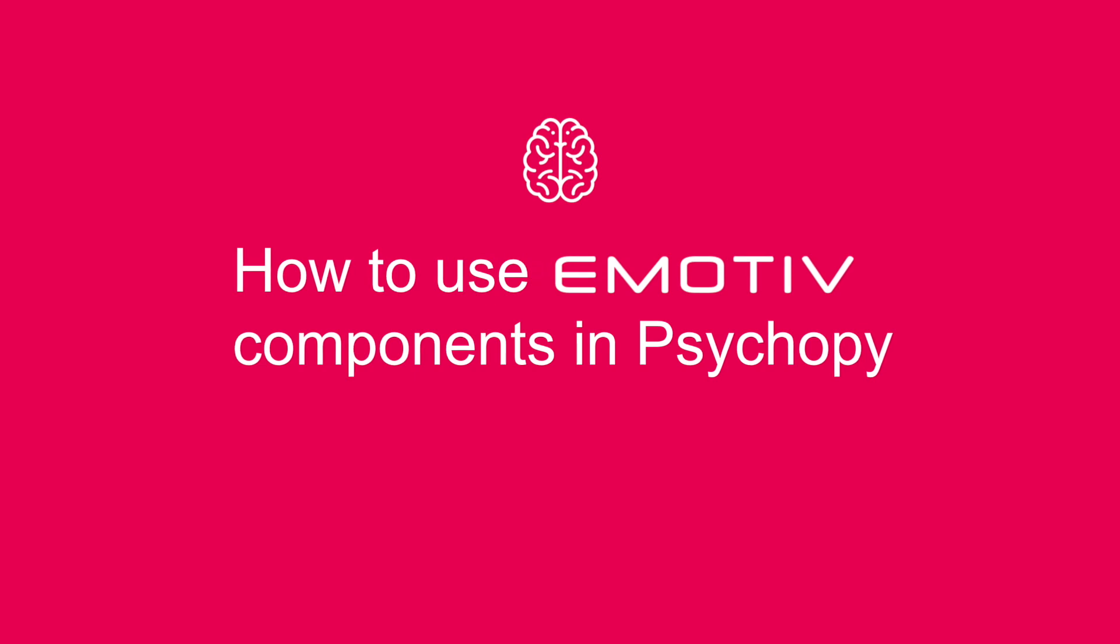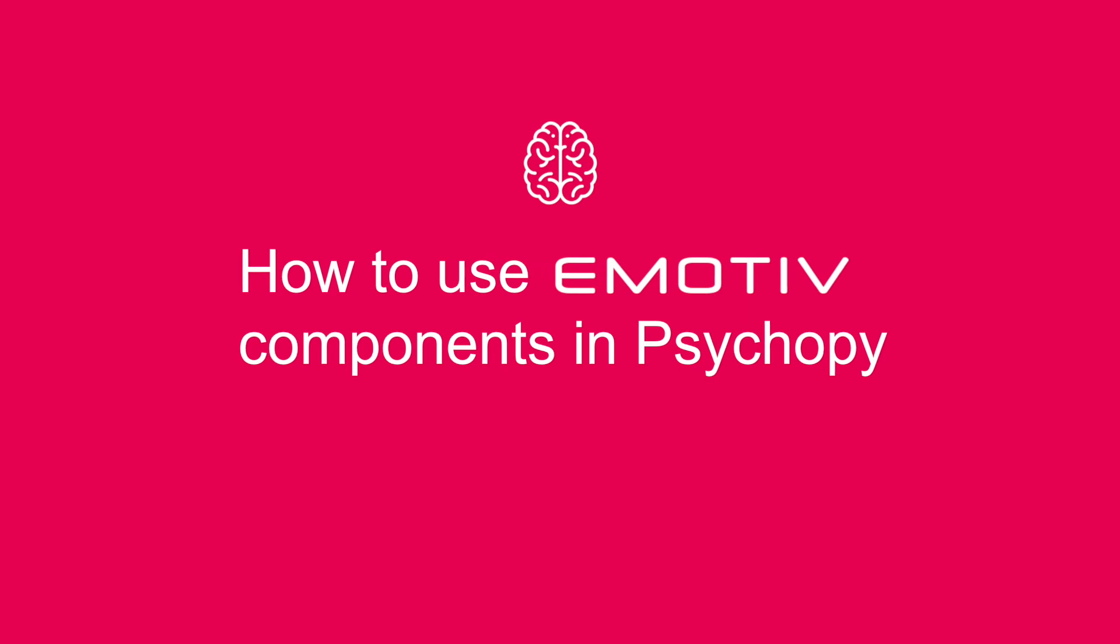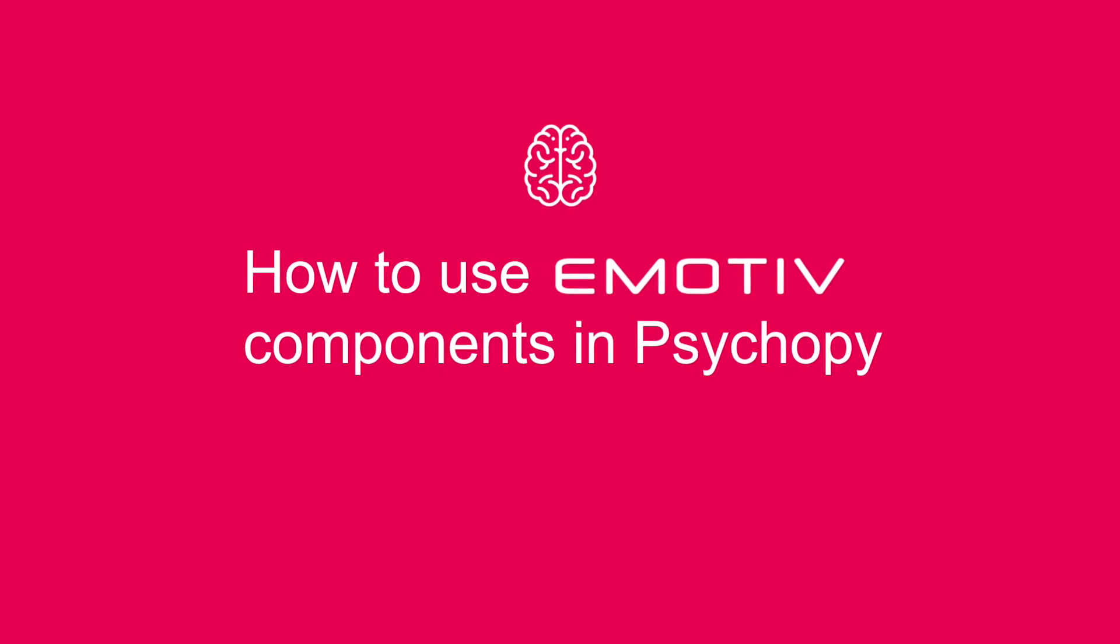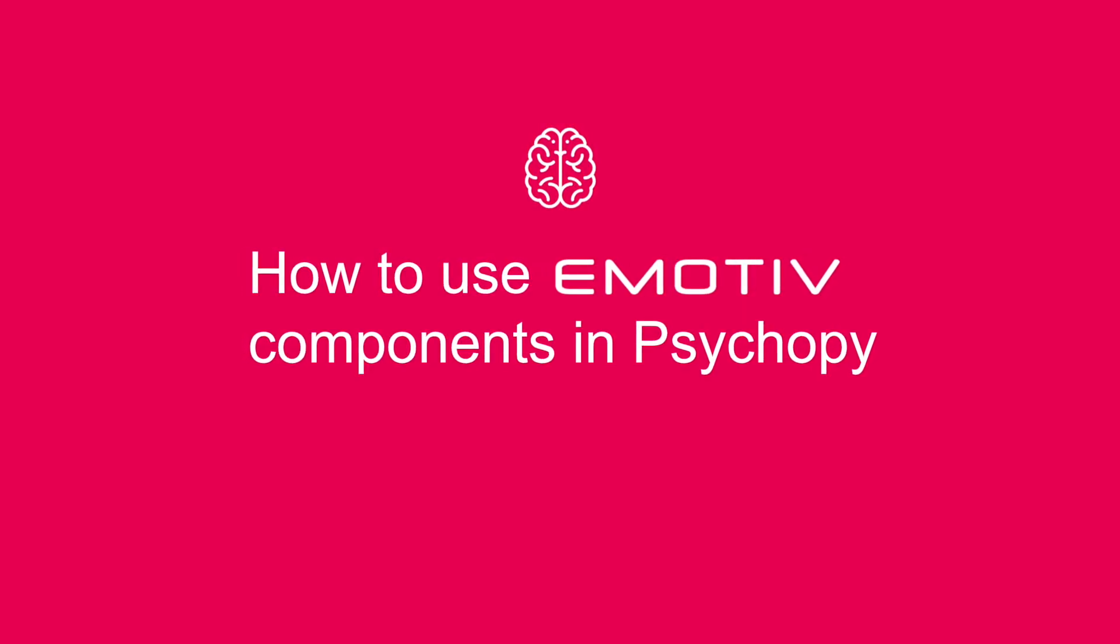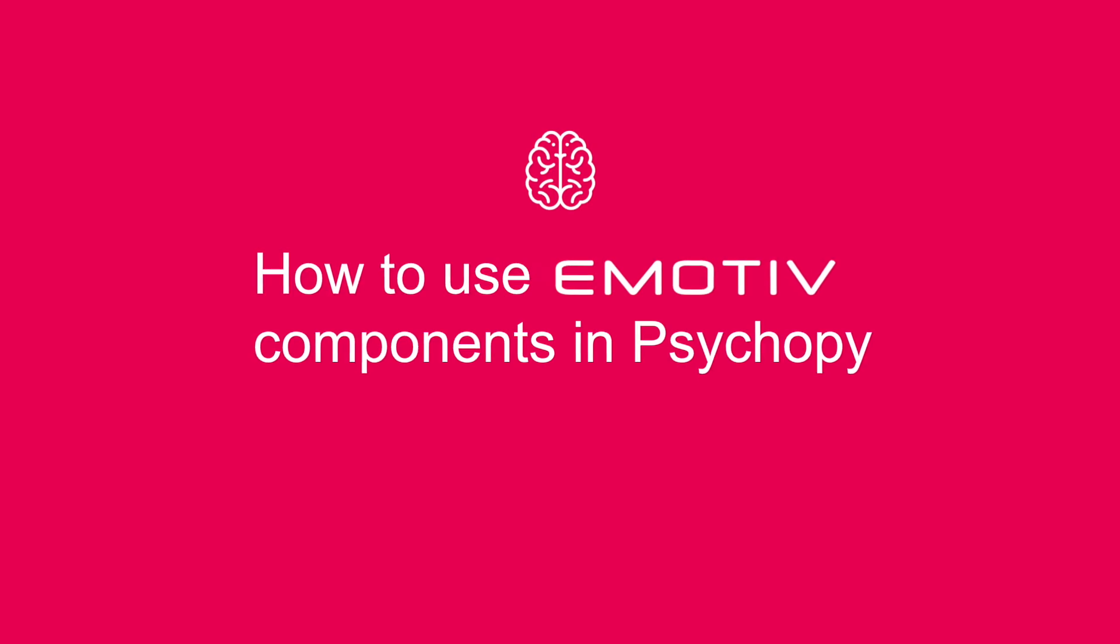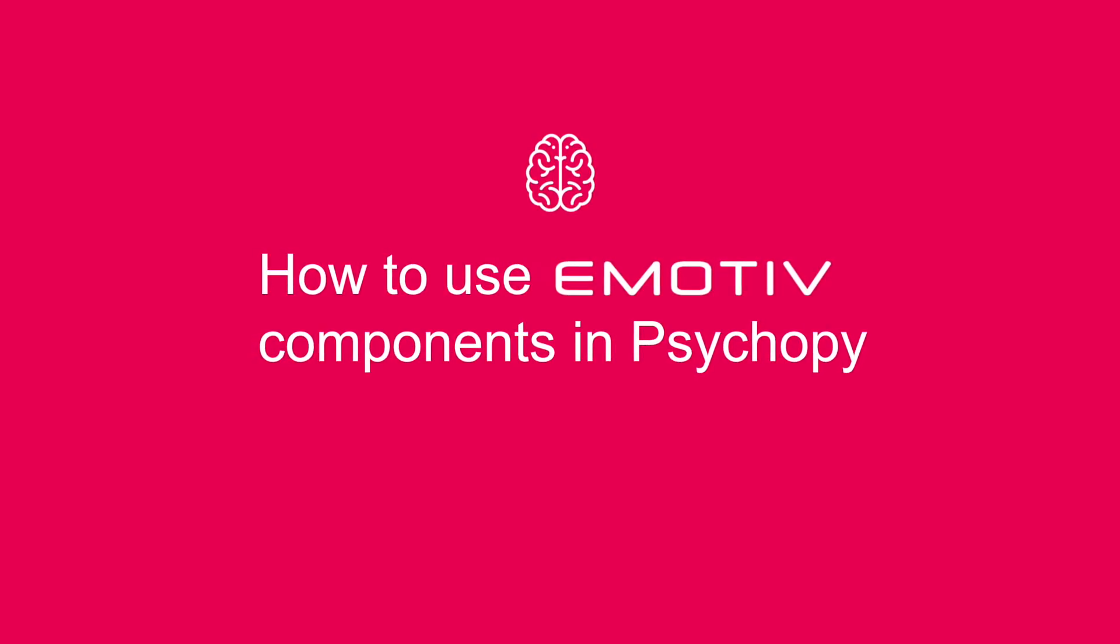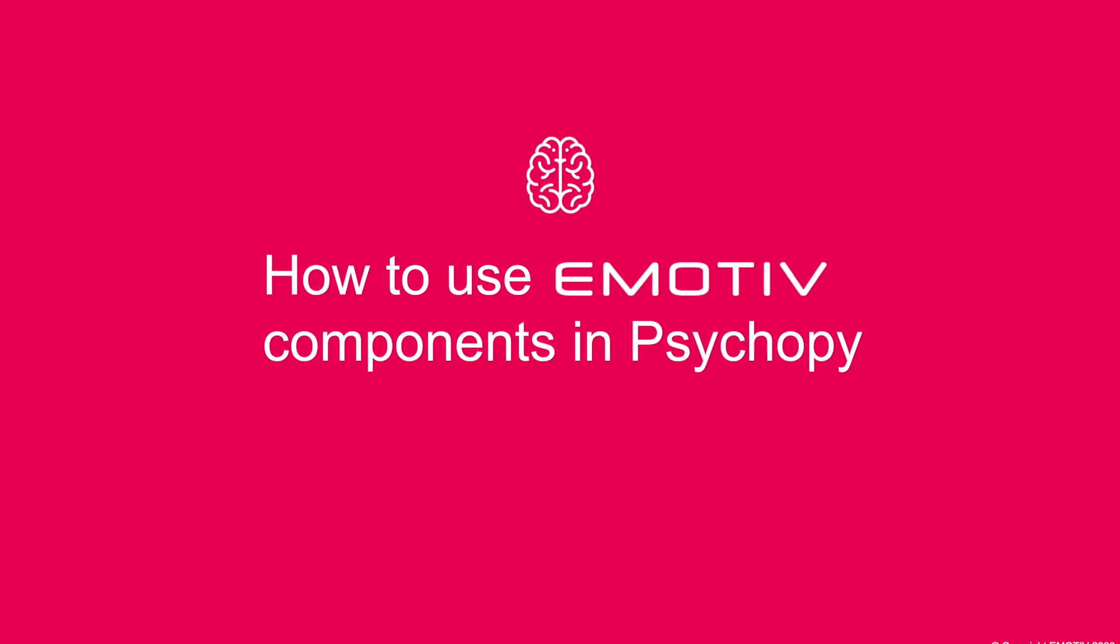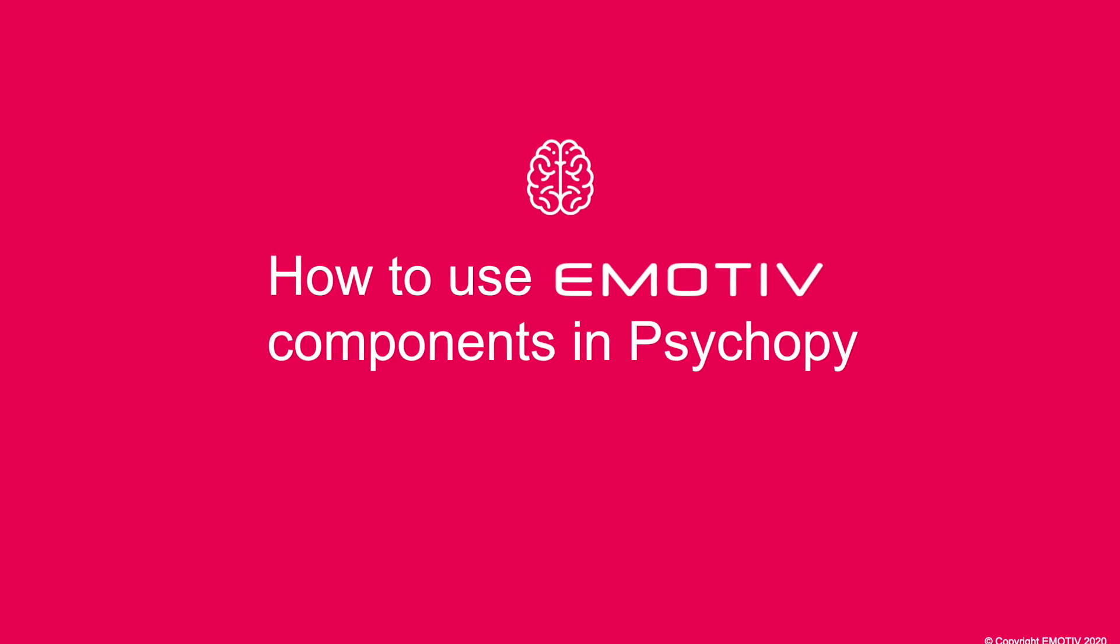In this tutorial we are going to create an auditory oddball experiment using the new EMOTIV components found in version 2020.2.3 of PsychoPy. We will be demonstrating the event related potential or ERP associated with the presentation of an oddball tone.